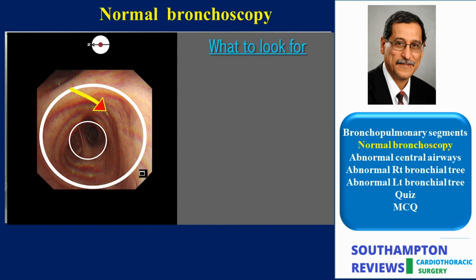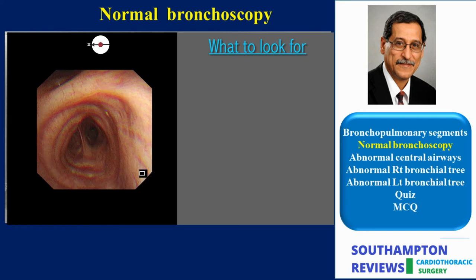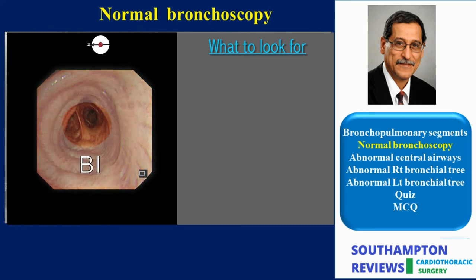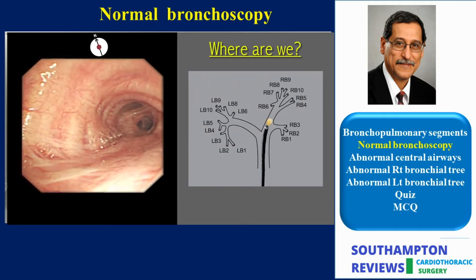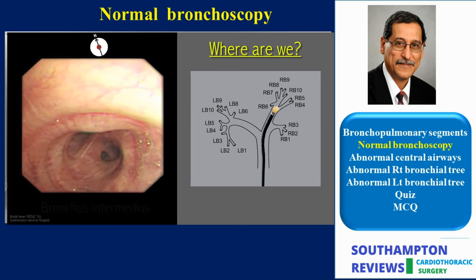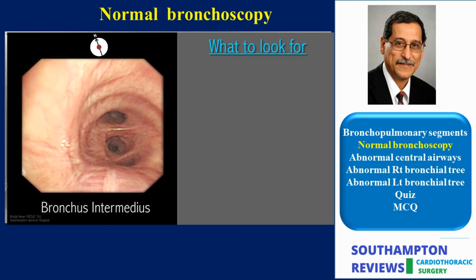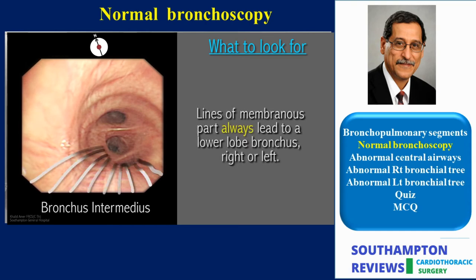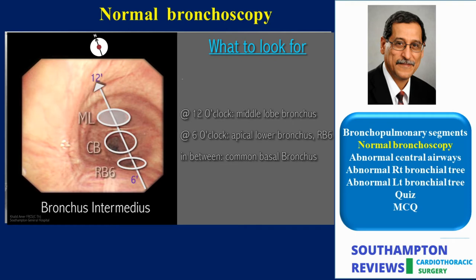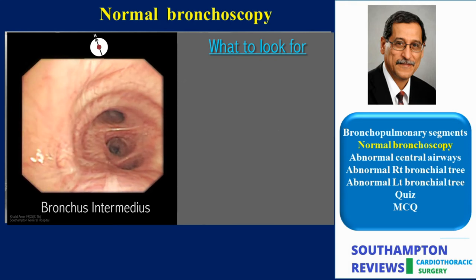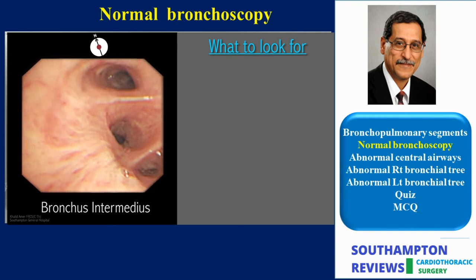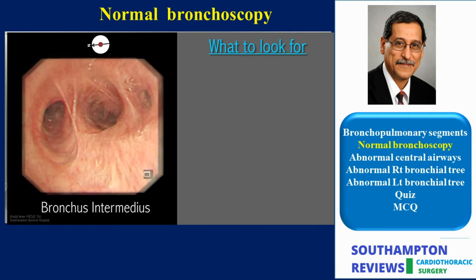The bronchus intermedius is practically the surface area from carina to carina. If the scope is turned 90 degrees to the left to align the primary carina vertically, then the floor of the bronchus intermedius is seen to be made of the membranous part. As a rule of thumb, the ridges of the membranous part will always lead us to the lower lobe. In this vertical axis, note is made of three bronchial orifices: the middle lobe at 12 o'clock, the apical segment of the lower lobe at 6 o'clock, and the common basal bronchus in between. Because it is difficult to align the three bronchi in this vertical axis, the bronchus intermedius is usually examined in the horizontal plane, having turned the scope 90 degrees to the right.